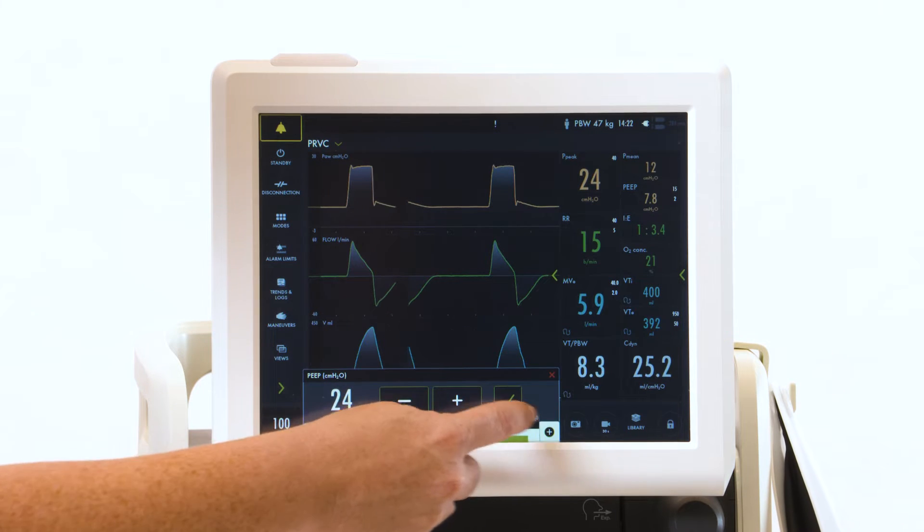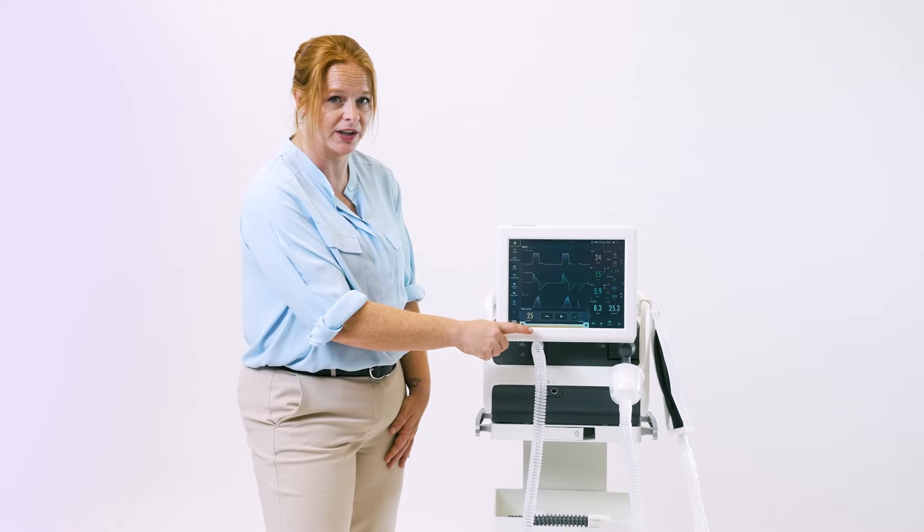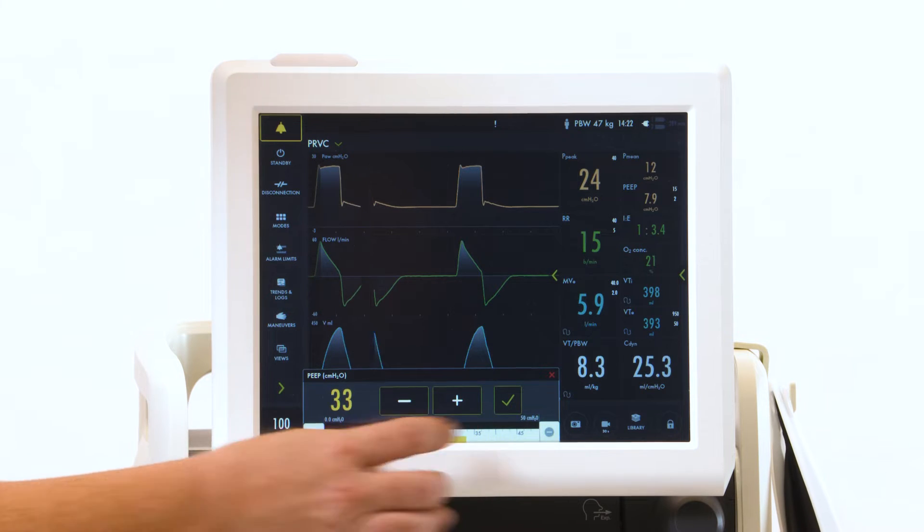When you move beyond the default, the scale will turn yellow, alerting you. Press the plus sign if you would like to go beyond that.